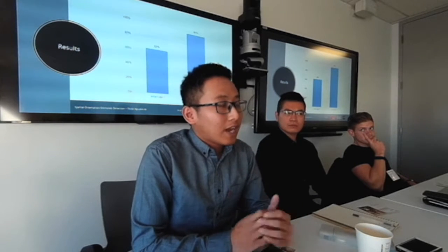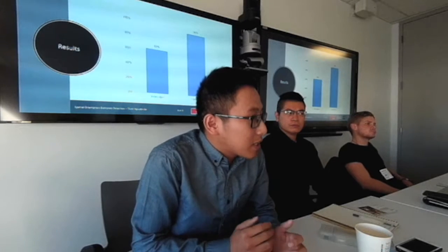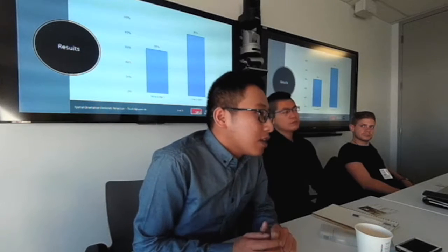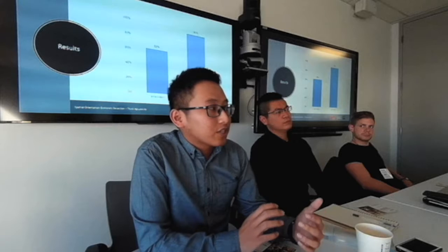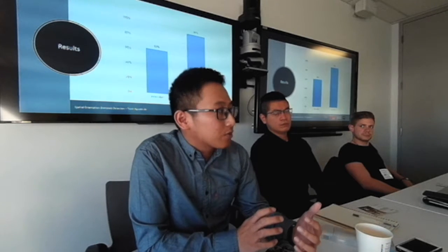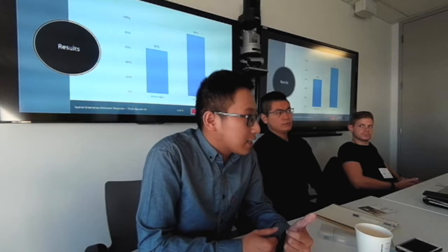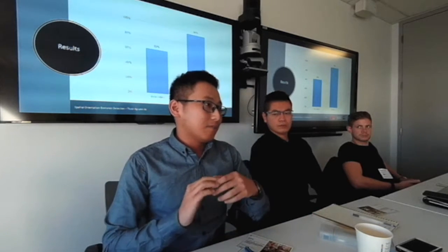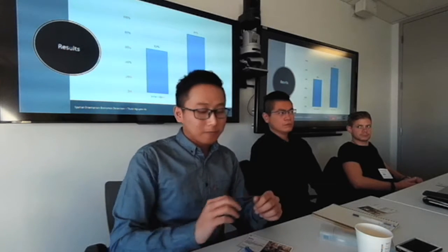With this high result, we can confidently say that CNN is robust for detecting spatial orientation demands in EEG data. For the next step, we will implement the actual software or plugin that other researchers and developers can use to monitor their users' orientation during virtual navigation. In terms of science, this study has provided a more objective approach to assessing spatial orientation in VR.